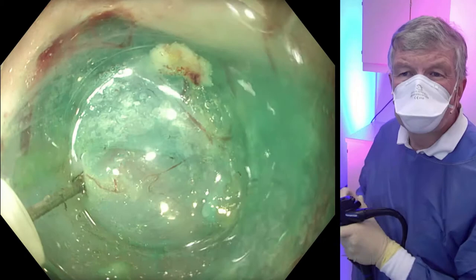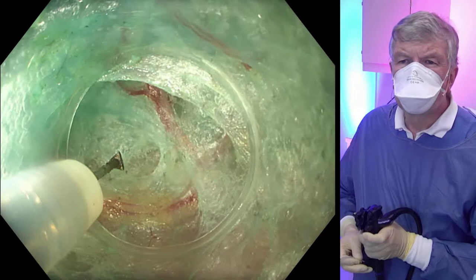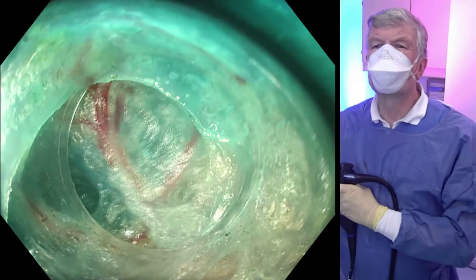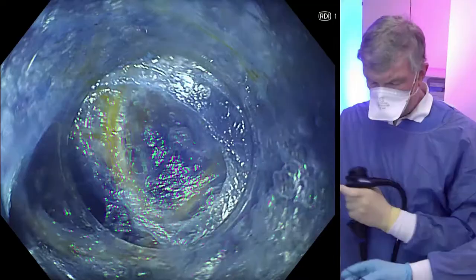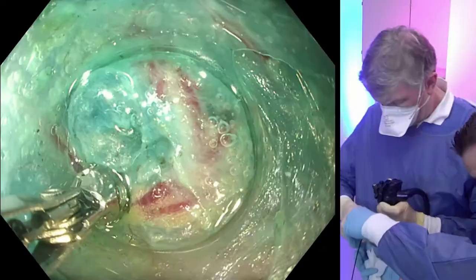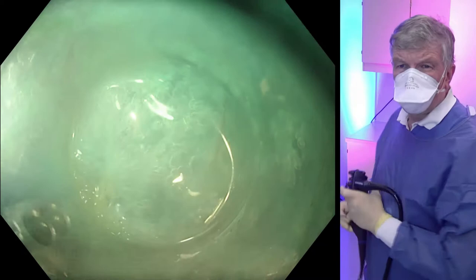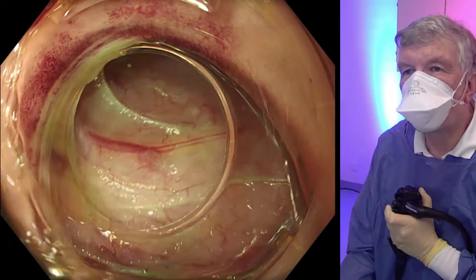Here we see the muscular layer — the circular muscular layer — at the bottom of the image. The vessels are treated by soft coag, but these vessels are basically too big for coagulation with a knife, so we have to take a coagulation forceps. Here we see the new RDI function of the new Olympus scopes, where the vessels are a little bit better seen. Here we are with the coagulation forceps coagulating the vessels. You can also dissect with the forceps step by step in areas with vessels.